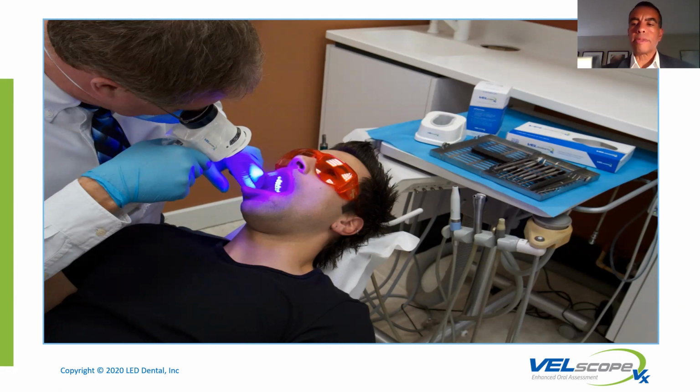So first and foremost, we have our VELscope. We're going to put our little plastic sheath over the VELscope. The mirror side faces the patient. We're looking at the other end. We then put a paper cap over that mirror side, with the mirror side facing the patient. We're going to be 2 to 3 inches or closer to the oral cavity. As we get further, that light's not going to be able to penetrate. So again, 2 to 3 inches, turn the on-off button in the front once, and we're on.